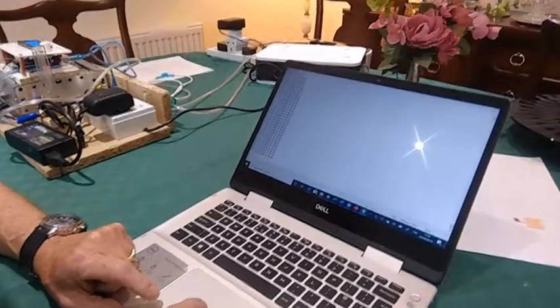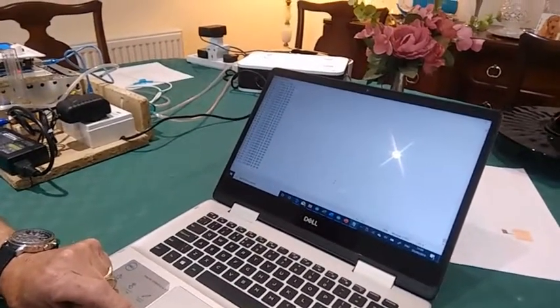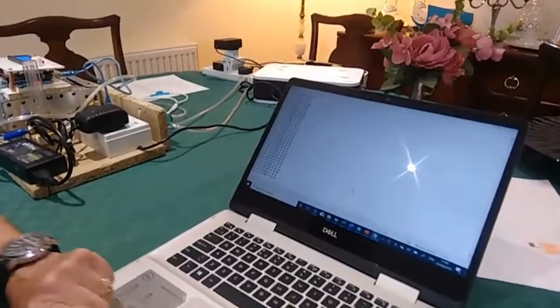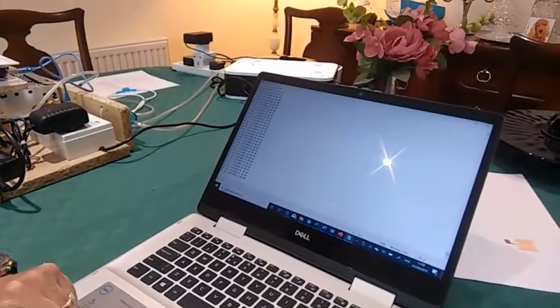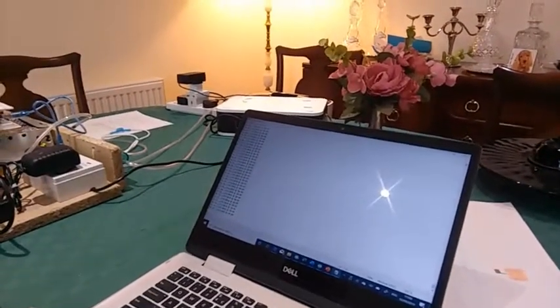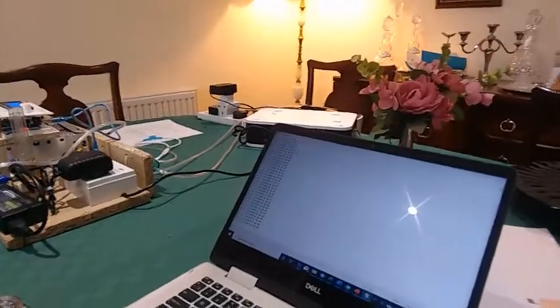There is a real-time clock present which shows that this is the 3rd of September finishing at 10:46, and here is the data collected every second.